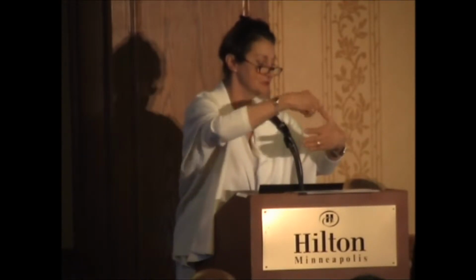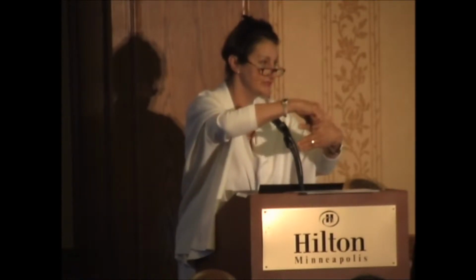So first of all, the competitive flow test. I'm going to just demonstrate here with my hand. Pretend this is the LAD, and Munir, thank you for showing me how to make a bypass graft with my hand. This is the LITA coming down. So here's the anastomosis. When we test for competitive flow, you snare proximally on the native coronary artery.